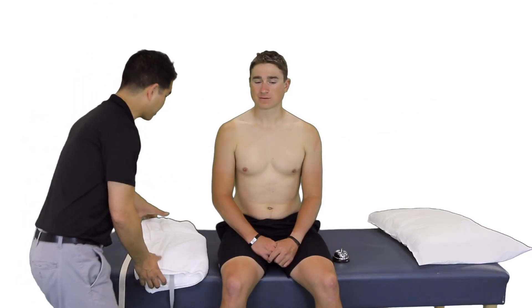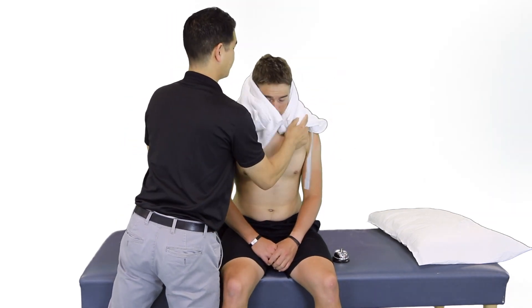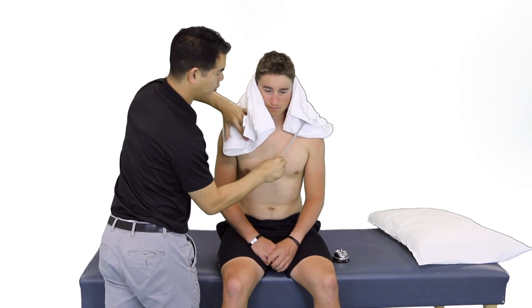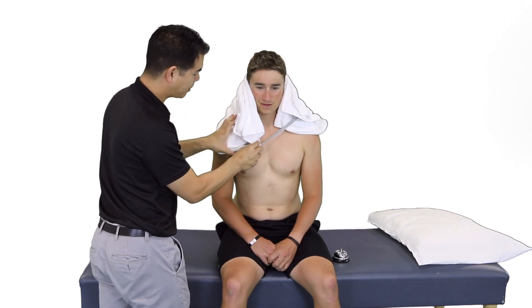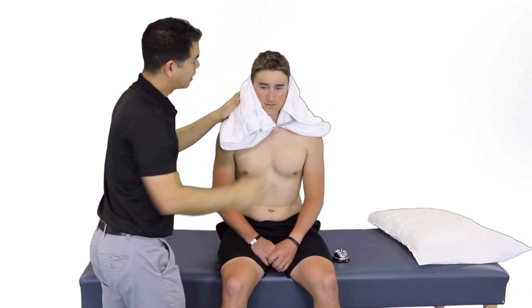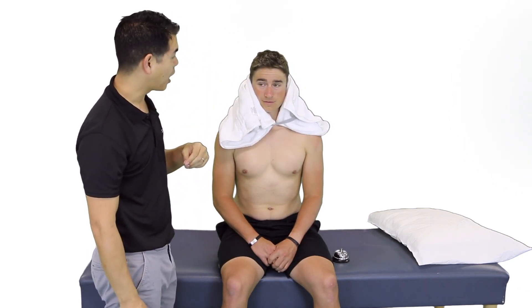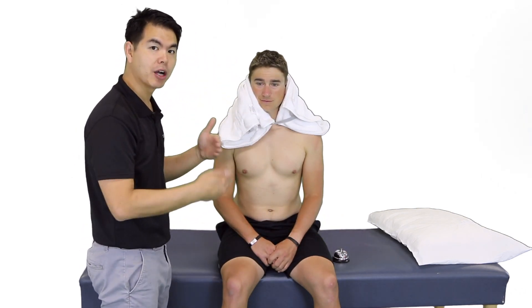We'll now apply the hot pack onto the patient — I'm going to drape this over your shoulders and we can lock it in with this little strap. Ensure that the patient is comfortable and doesn't have any feelings of claustrophobia. We can remove towel layers as needed or add towel layers if it's too hot. There's going to be a bell here so the patient can let us know of any problems, and we'll keep checking to ensure the hot pack is at the appropriate temperature.